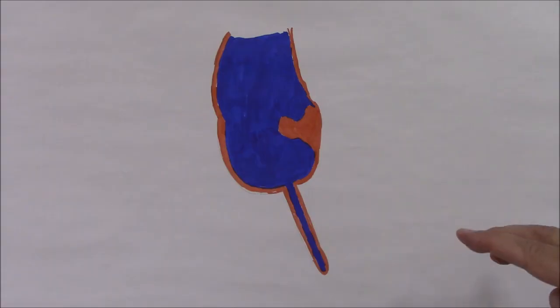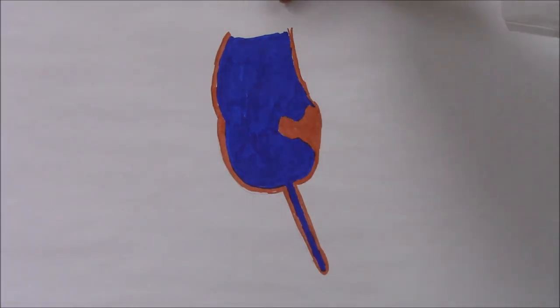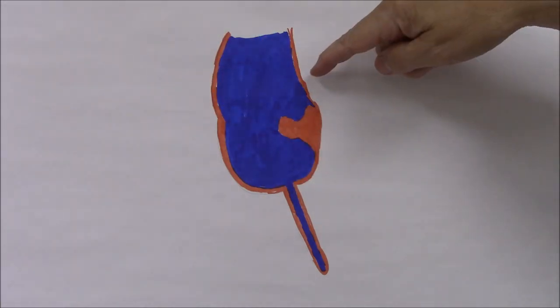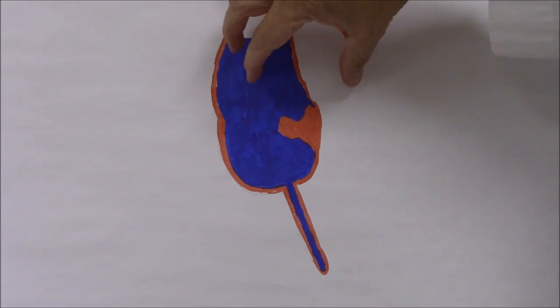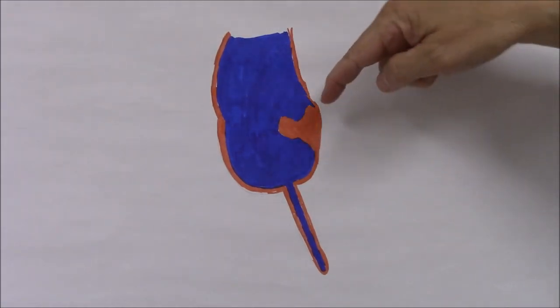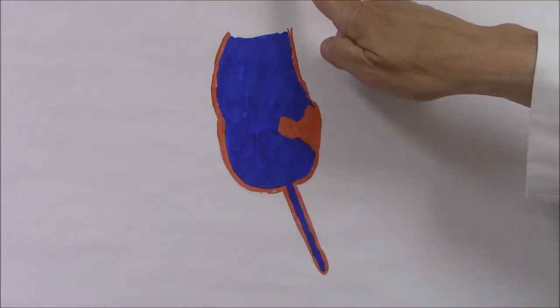The very best way to get the valve orifice turned toward you so that you can see it and enter it more easily is to remove the gas from the cecum and ascending colon and fill it with water. This will tend to make the colon collapse, and it'll really roll the valve up so that it's no longer with the orifice pointing toward the cecal side, but rather toward the anal side.